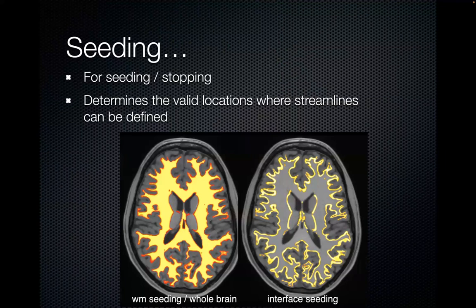But that's where also it's. First, we need to start from somewhere, and we need a domain for tractography. Okay, and so in all tractography algorithms, you need a seeding mask. Where do you start? Where do you seed?